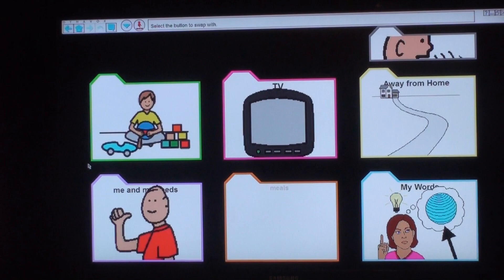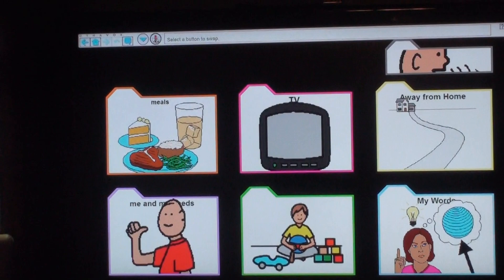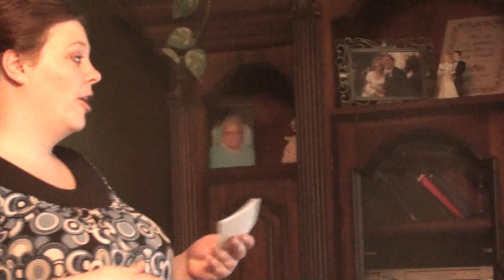Once you have the buttons in the places you want, just hit modify at the top, and that turns off the swap button mode. But no matter how we place the buttons, if her device is not well programmed, it's kind of pointless. The instruction manual suggests that we make her device organized, personal, meaningful, and fun. In order to do that, we have to think about what Rochelle needs and wants. That initial programming is limited to what we could think of at the time, so you're going to find things that need to be there and aren't. If you find a need, the first thing is to figure out if there's a pre-programmed page that's close to what you need or if you'll have to make a completely new page — I'm going to show you how to do both.